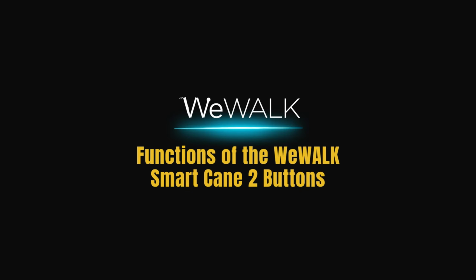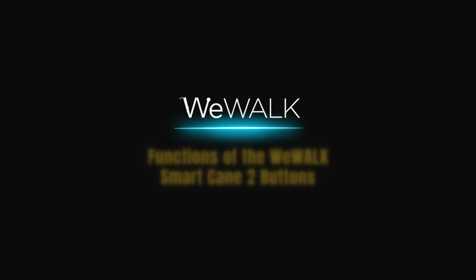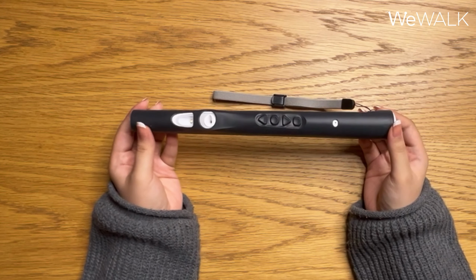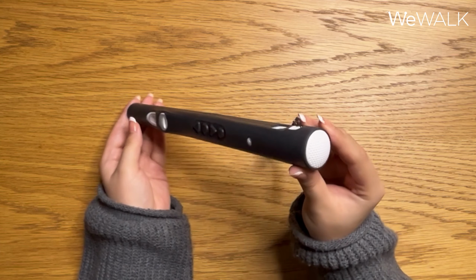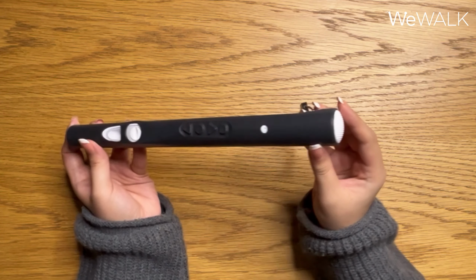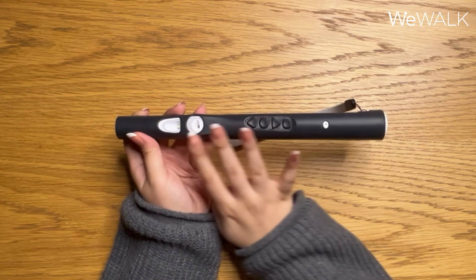Functions of the WeWALK Smart Cane 2 buttons. To start off, I will be explaining all of the features that are present on the WeWALK Smart Cane 2. At the very top, we have the speakers where all of the sounds of the cane are outputted from. Next, I will be explaining the front side of the cane.